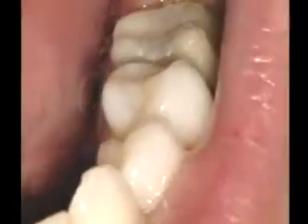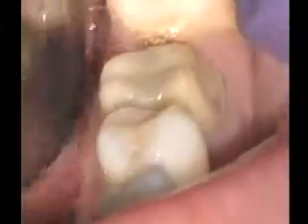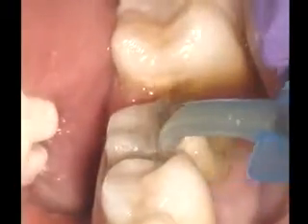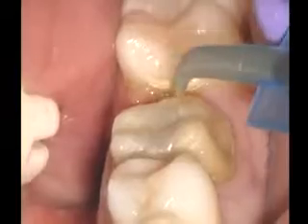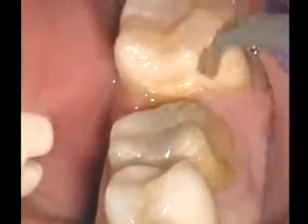When bonding or luting a crown, the gingival tissue should be healthy. Hemorrhaging is not usually a problem, but sulcular fluid is. A plastic blue Mini Infuser tip, loaded with Viscostat, is used to seal the epithelium and prevent sulcular fluid contamination.